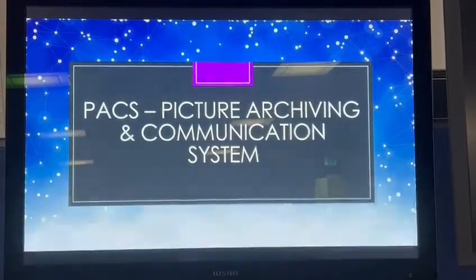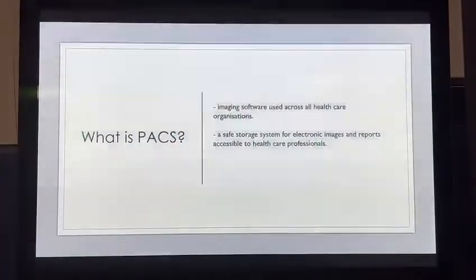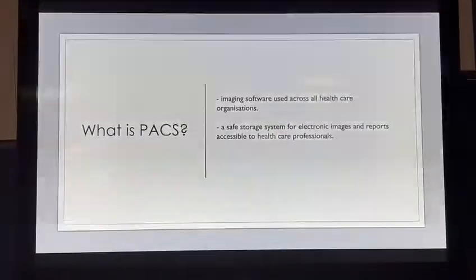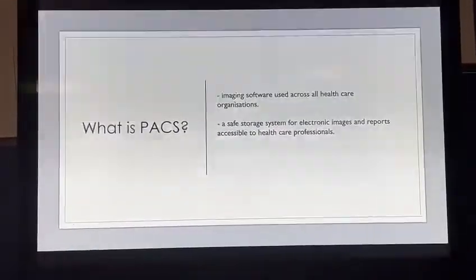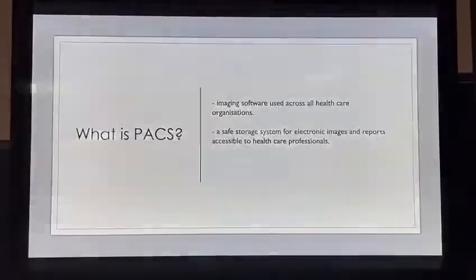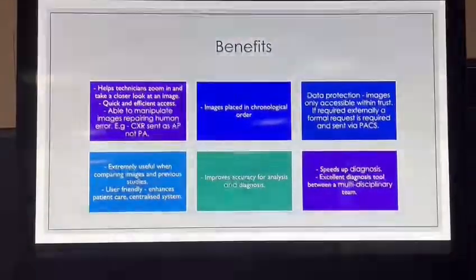PACS stands for Picture Archiving and Communication System. But what is it? PACS is an imaging software used across all healthcare organisations. It's a safe storage system for all our electronic images and reports which are accessible to all healthcare professionals. There are many benefits to PACS.